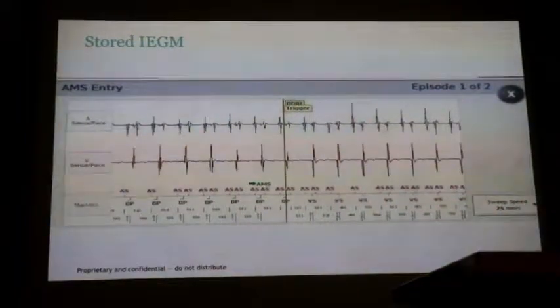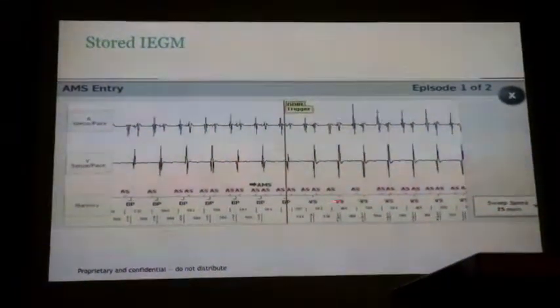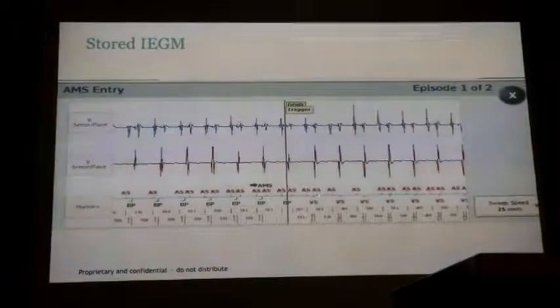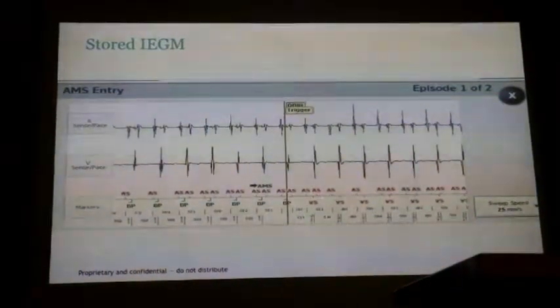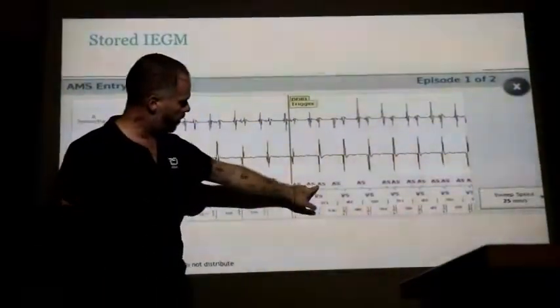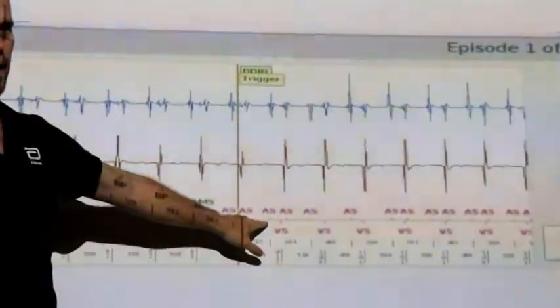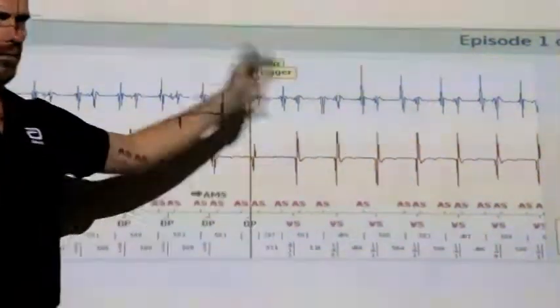There is a decay delay and threshold start on the P wave, but if we wanted to undersense this signal here, we would have to be changing the decay delay threshold start on this. Yes. That's a long way away. Yeah, that's like 200 milliseconds away.